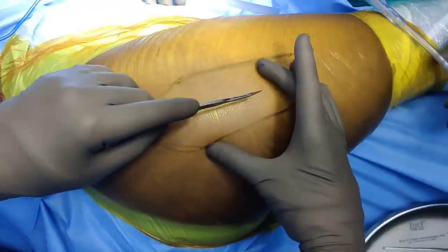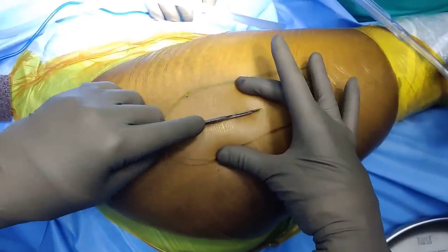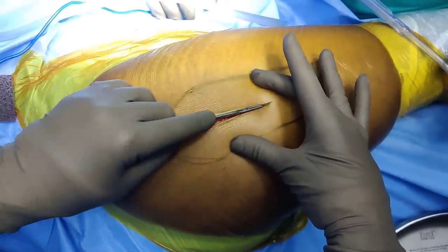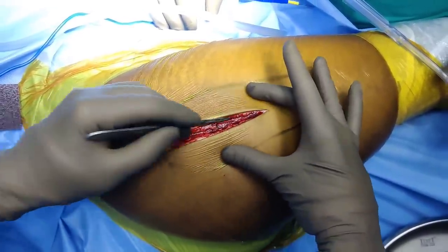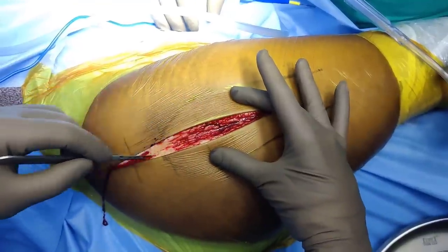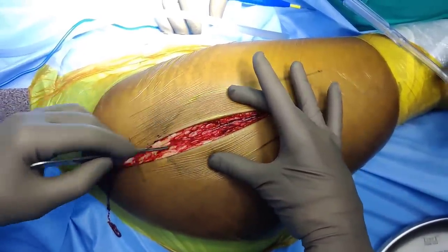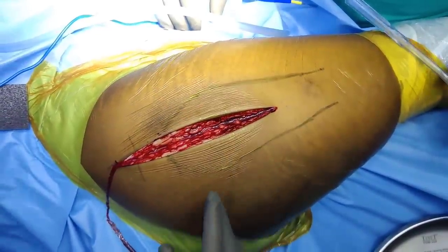The skin incision is pretty straightforward, nothing special about it. The superficial dissection is the same as in a hip replacement. We will be dividing the skin, subcutaneous tissue, and the fat layer until you encounter the fascia lata. Let me just do this dissection, reposition the self-retaining retractor, and then I will join you back.